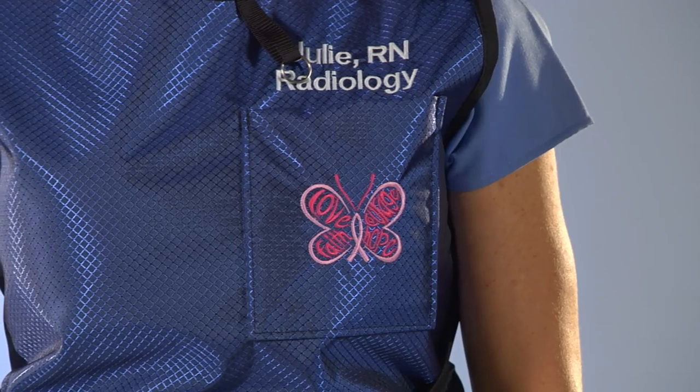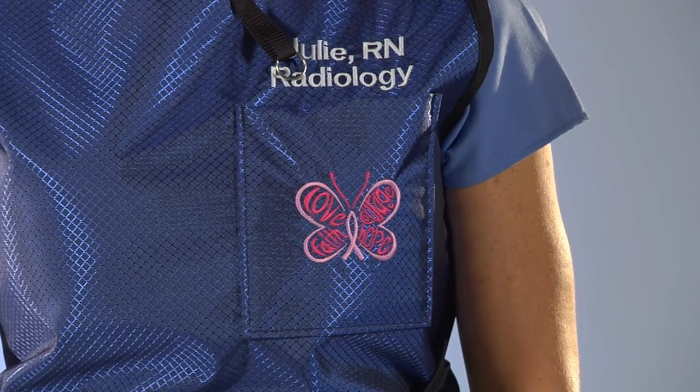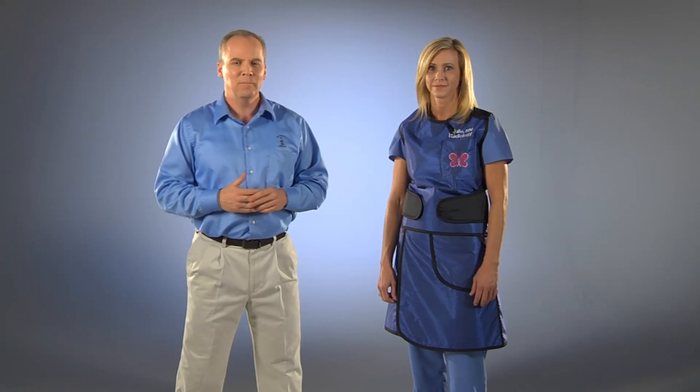The PVK includes your choice of over 80 fabrics, a chest pocket, embroidered design, and two lines of embroidery text. We can also embroider your own logo for an additional charge. All of our aprons include a thyroid shield tether to attach to one of our thyroid shields. You can also get an additional film badge tether. The PVK can be custom sized to your measurements to provide the best fit. Please see our measuring video for measuring instructions.